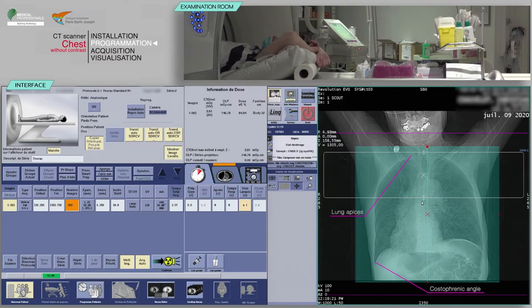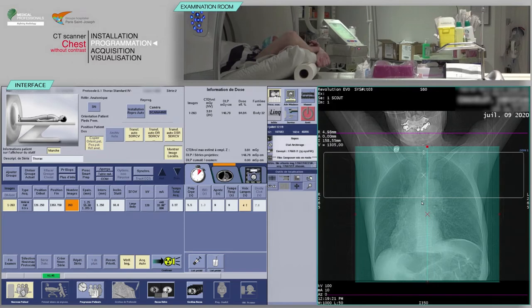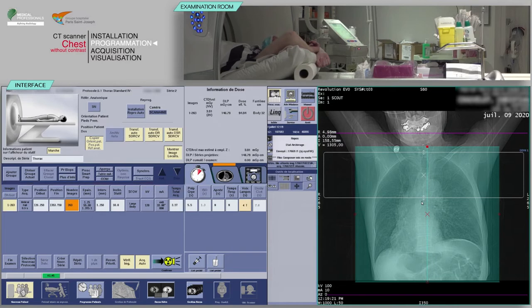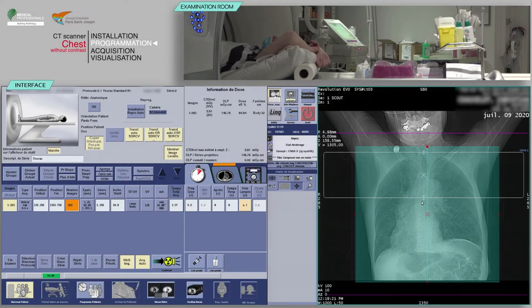In addition, check the alignment of the box positioning and place it mid-thickness of your patient. Check the consistency of the acquisition parameters, which are often pre-configured. Before continuing, check that the predicted dose is consistent with the diagnostic guideline values.